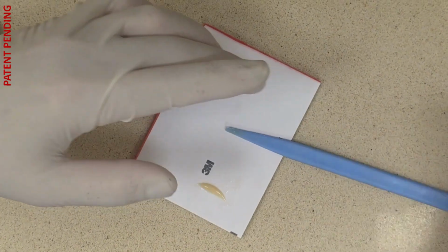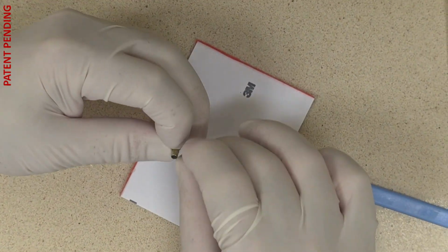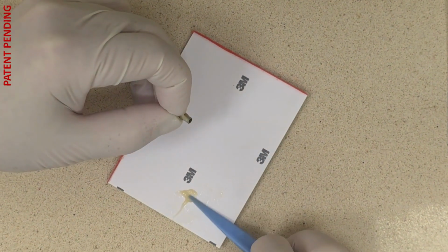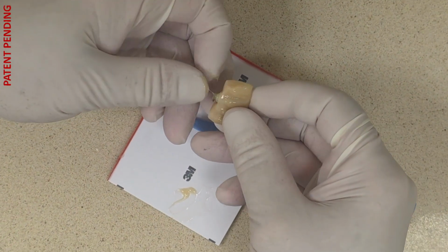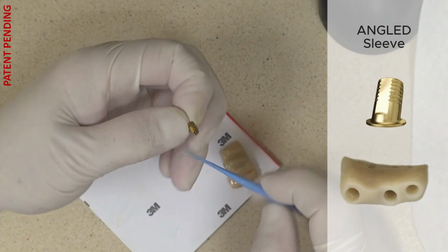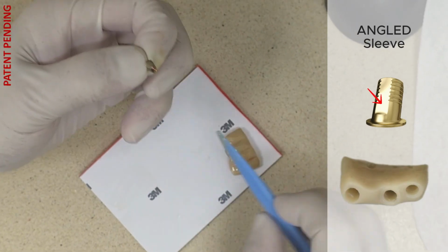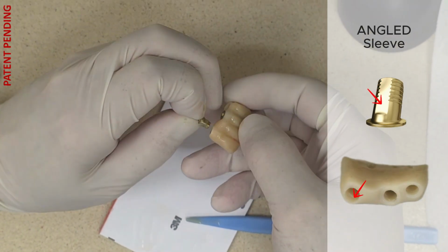Adhesive is applied to the sleeves, the screws are already inside them, and the sleeves are inserted into the bridge. It is essential to perform these steps horizontally so the screws do not fall out of the sleeves. A Crest Fit sleeve can only be seated in one orientation. The flat surface must face strictly toward the buccal side. The bridge channel has the same flat surface, ensuring precise insertion and preventing rotation.